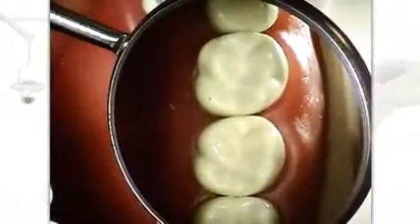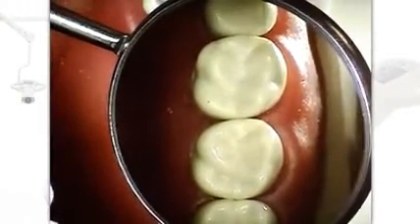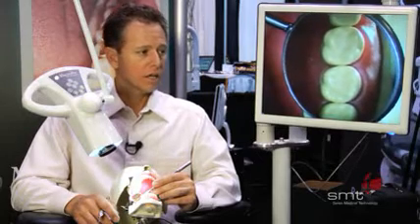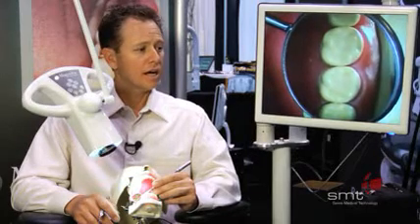What I see as the advantages of the Dentaloscope 2D is, first of all, ease of use — it's very simple, very quick to set up. Within a matter of 15 seconds, you can have it set up to work on any tooth in the mouth. Secondly, I'm able to sit upright and work off of the screen so I don't have to look down and don't have any of that neck and shoulder pain from using loops. I'm able to zoom in up to 24 power, and it also has very bright LED lights that don't emit any heat but really illuminate the mouth.